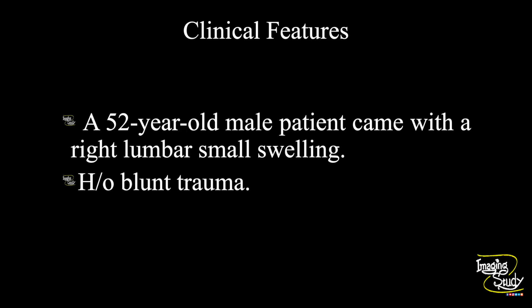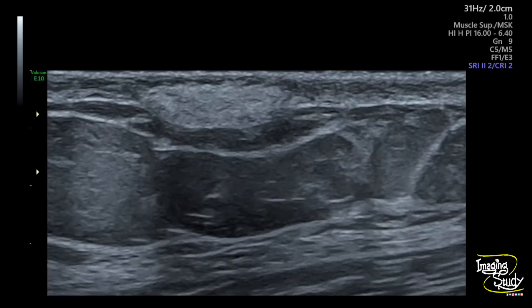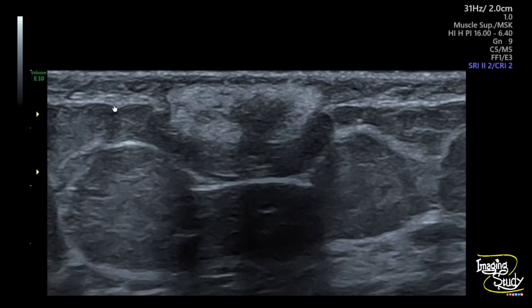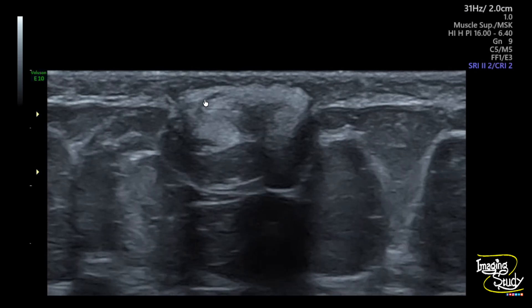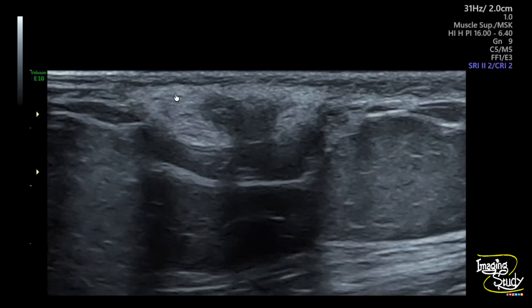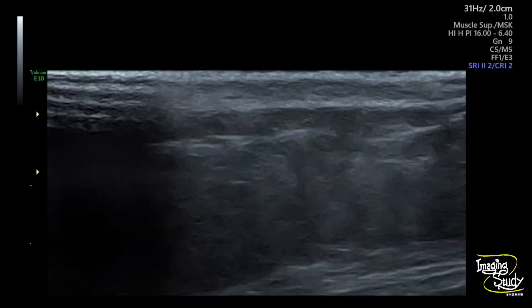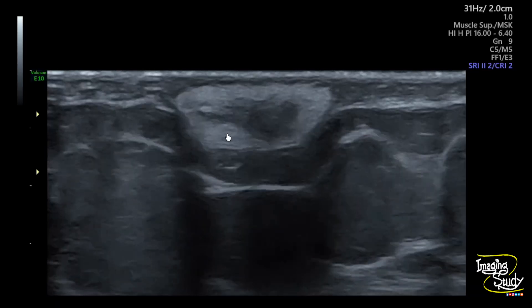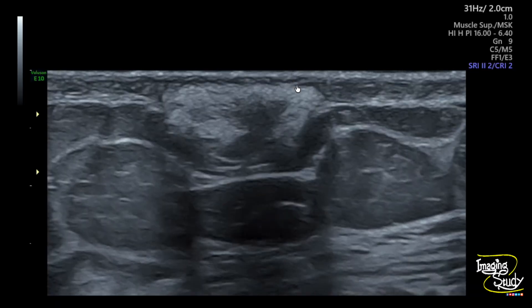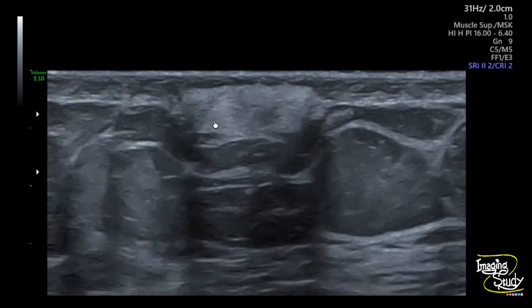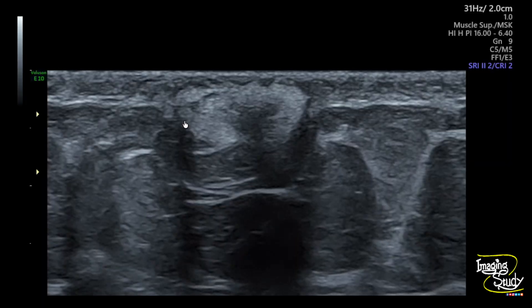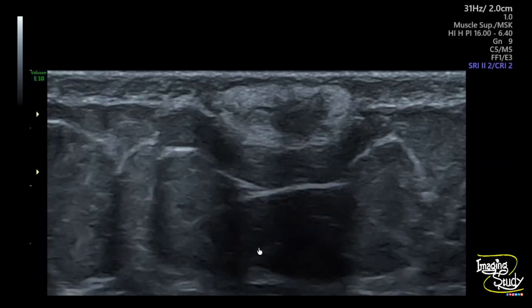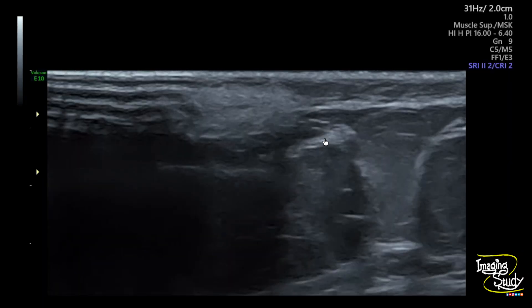Let's see what we have got on ultrasound. Here you can see the high frequency ultrasound of the right lumbar region. The abdominal wall shows a heterogeneously hyperechoic area just below the skin. You can see this echogenic area is the outer part and it is thickened, but the central part looks hypoechoic. So it is confined within the superficial layer. No intra-abdominal communication is seen, so it's a localized lesion.